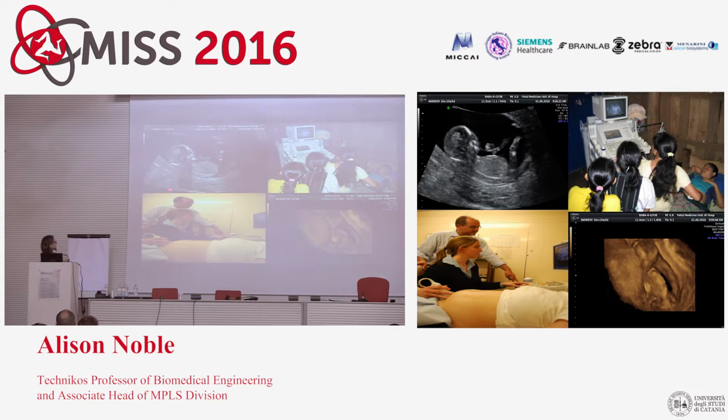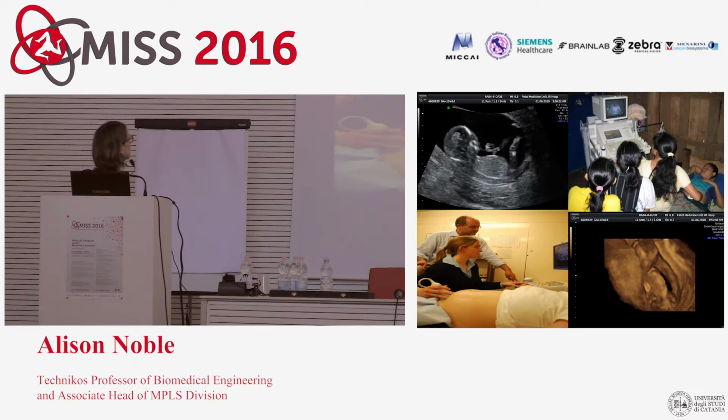So this is the data you get from 3D ultrasound, but that's not so typical. Most of the work in the field is done with 2D ultrasound. If you're not used to it, the data looks really hard. But when you've seen about 20 of these, they all start to look the same. You get these characteristic signatures around the heads, for example. There's a little texture pattern here that, at least in this case, shows that the baby's alive. So there are really important cues used for interpreting this data.